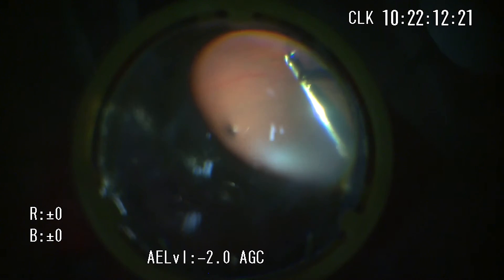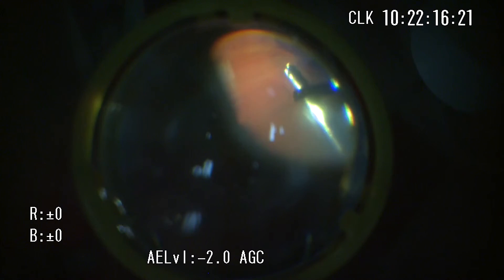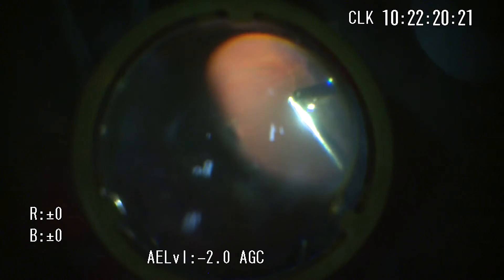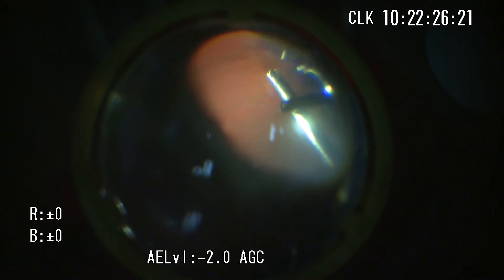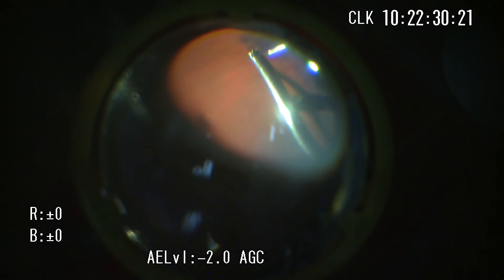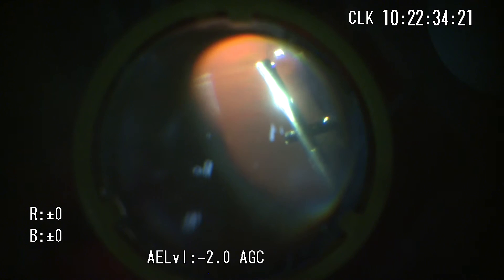The retina is detached and mobile during vitrectomy under fluid infusion. Scleral indentation provides some degree of immobilization of the retina under fluid infusion. However, it becomes possible to shave vitreous on the surface of a completely immobilized and attached retina under air infusion. So the risk of iatrogenic retinal breaks can be decreased.